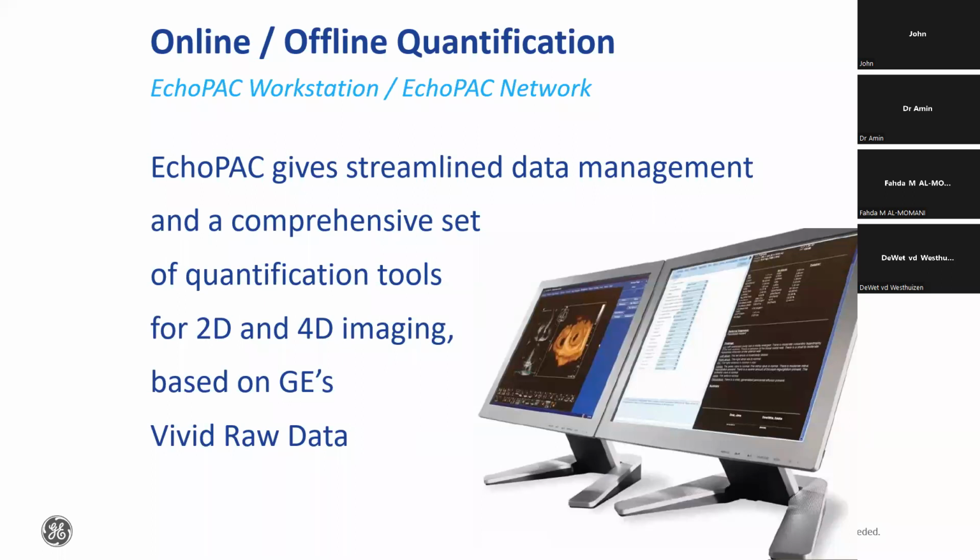It is on the spot, no radiation. It is real time. It can be 3D surface rendering. It can also have slices in 2D with flexi slice, with multi slice. That can give us a lot of information about the anatomy and the structure, and guidance also during the procedure of the position of the landing zone, of the sizing as well, and checking the outcome on the spot upon implant and post implant as well.